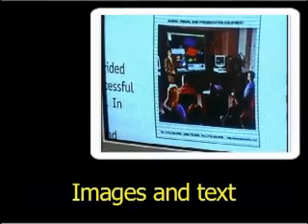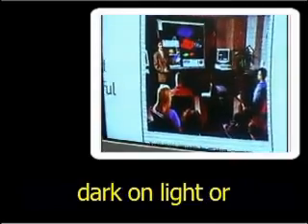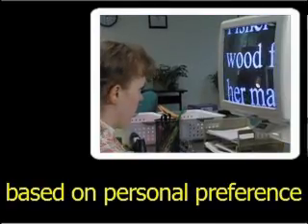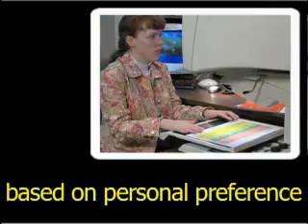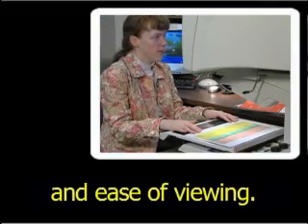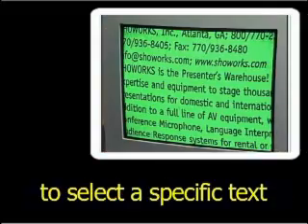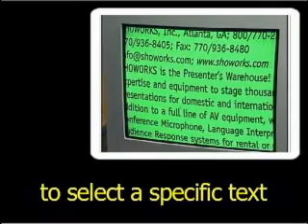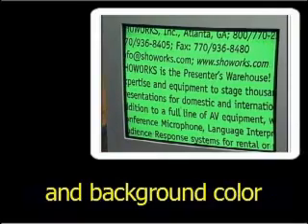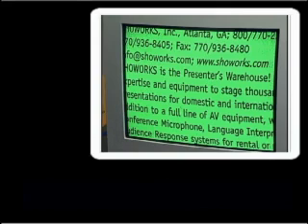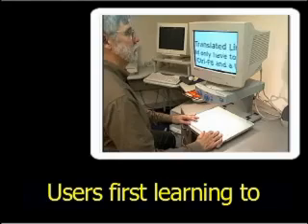Images and text can be viewed as dark on light or reversed based on personal preference and ease of viewing. Some models allow the user to select a specific text and background color, as demonstrated in this scene: black text on a light green background.